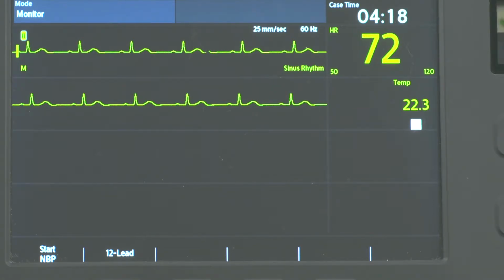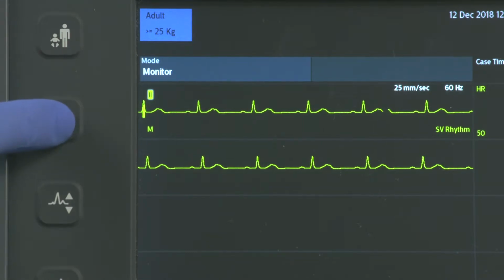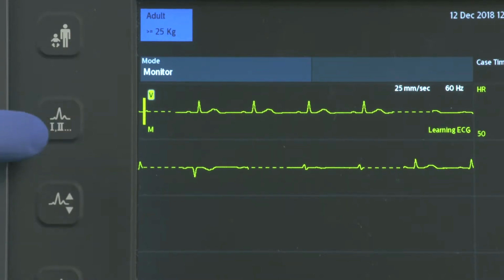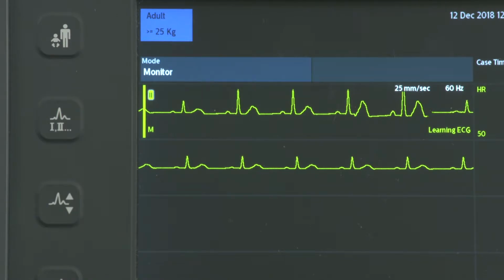You can also change the waveform for each sector during a patient event. How to change a waveform differs depending on if you are in AED mode or not. In non-AED mode, the ECG wave for wave sector 1 is selected through the Lead Select button or through the displayed Waves menu. Use the ECG Gain Select button on the front panel to adjust the ECG waveform size for the primary lead.